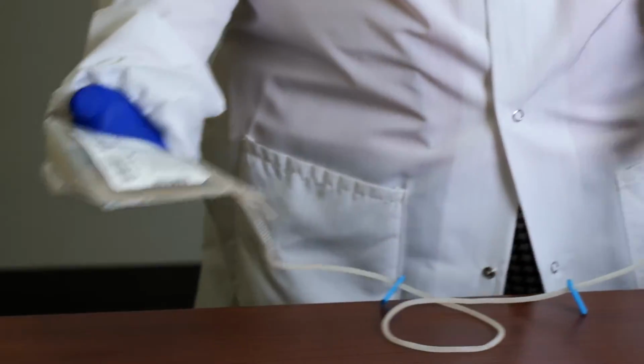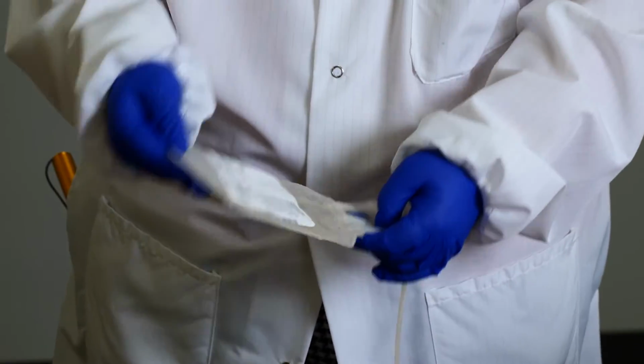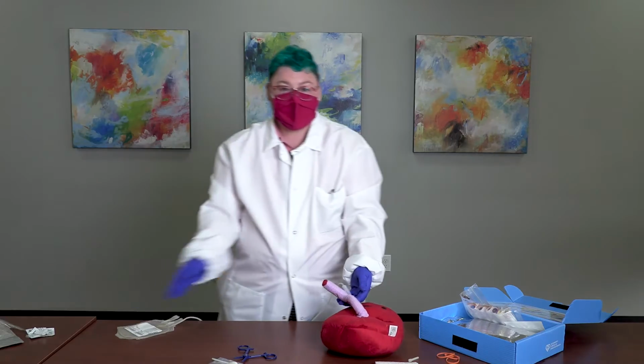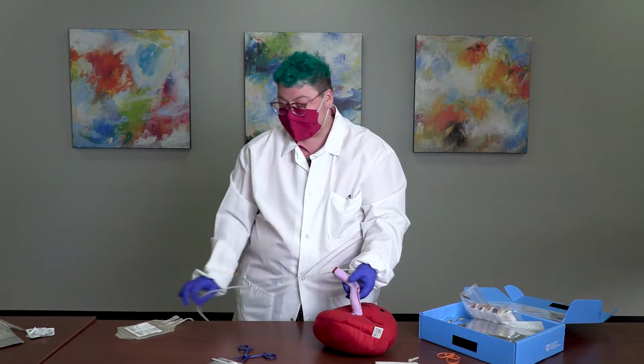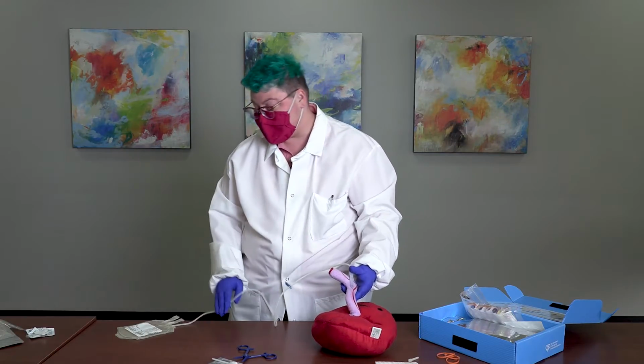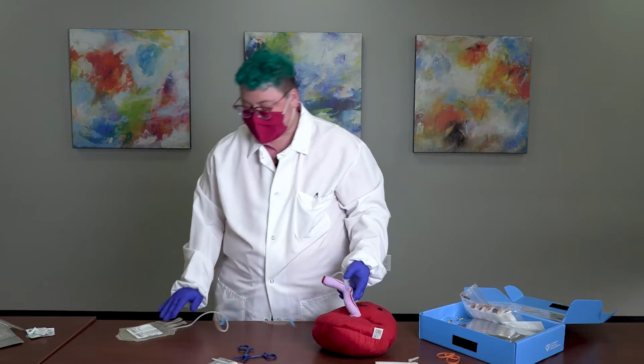To prevent clotting, we recommend gently rocking the bag and, as mentioned before, placing the bag slightly lower than the umbilical cord. Please be patient when doing the collection. Even a few more seconds of collection time can make a difference for a patient in need. The number one reason we're not able to use cord blood collections is there's a low volume. For this valuable donation to be used for a patient in need, there does need to be enough active and healthy cells that it can be transfused into a patient. So please wait just a little bit longer before removing the needle.